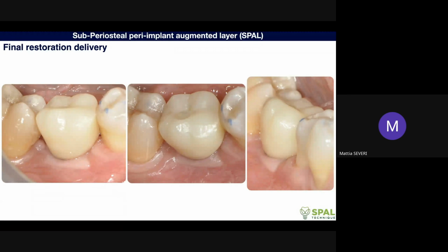You know, when you have to manage an atrophic posterior, a horizontally atrophic posterior mandible, you can start by default with this kind of flap. So you will be ready to correct a peri-implant dehiscence, either that you have diagnosed this on a 3D exam, or when you face a peri-implant bone dehiscence when, for some reason, the CBCT exam wasn't precise in previsualizing it.